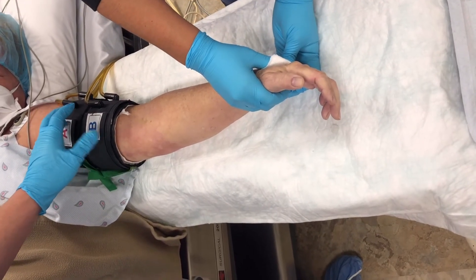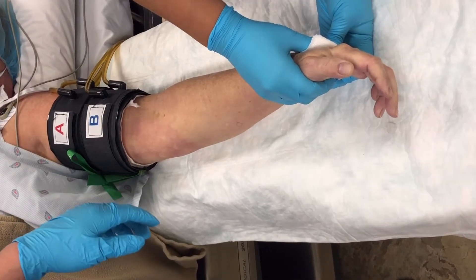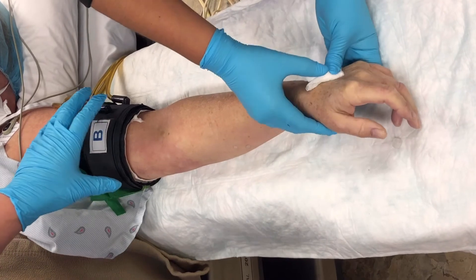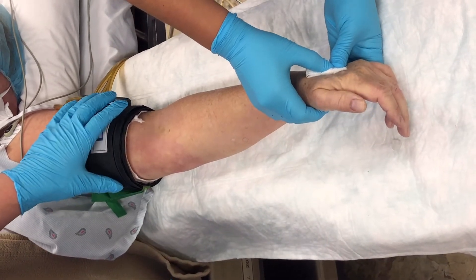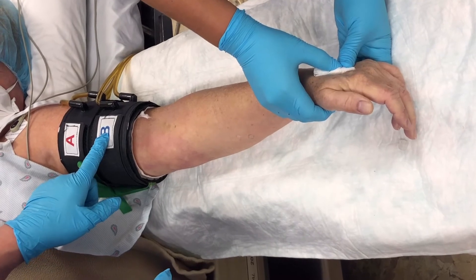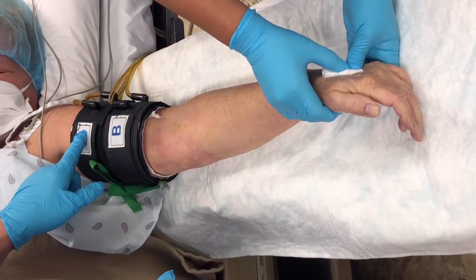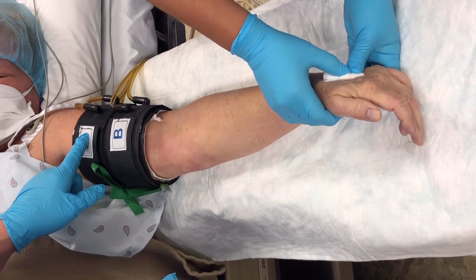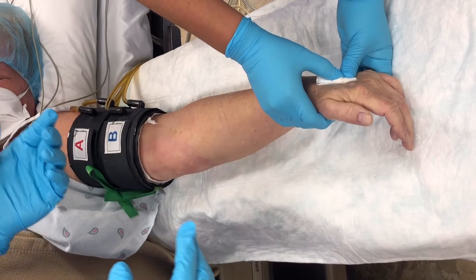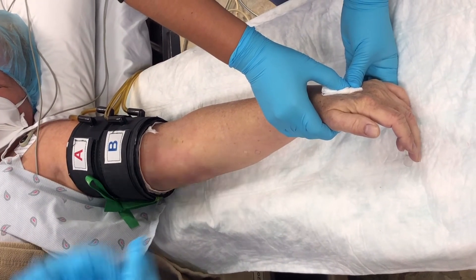Generally, the tourniquet — patients tolerate it for about 20 to 30 minutes. After 20 to 30 minutes it will become uncomfortable. At that point, I will inflate the distal tourniquet and then release the proximal tourniquet. That will last another 30 minutes, so the total procedure is good for about one hour of surgery.